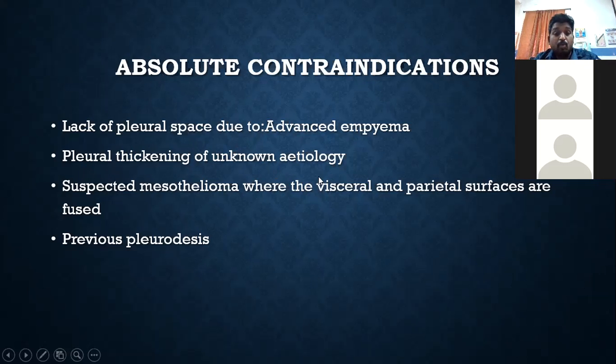Those patients who have a fused pleura, with extensive pleural thickening, you could not perform thoracoscopy very well, because if the patient has pleural thickening, obviously rib crowding will be there. If rib crowding is there, it is very difficult for the trocar to enter. So in some cases we found difficulty, but even then we can retract the rib, and we can put the trocar.